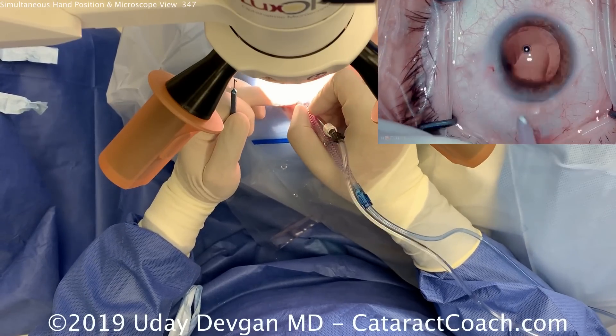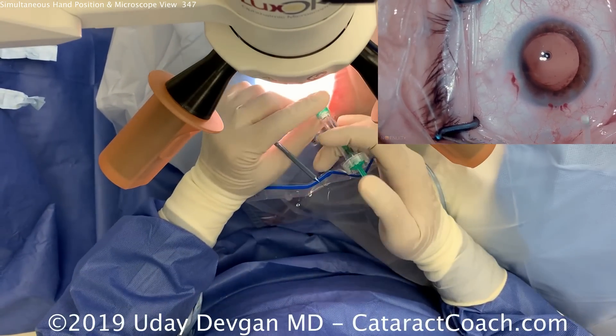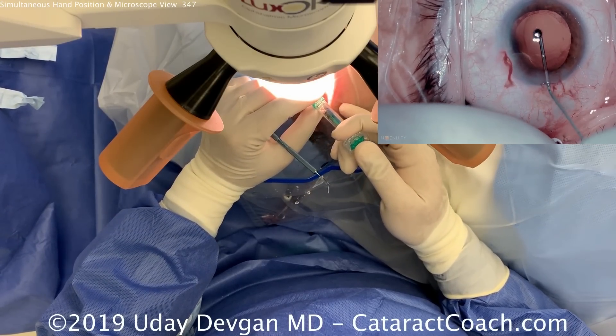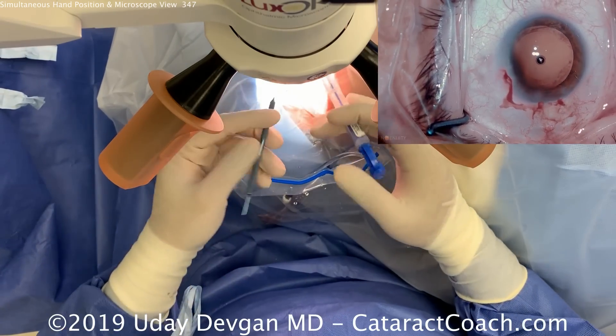We want to keep the eye in primary position. A little capsular bag polishing and we're done. Keep the I&A probe in that pocket and fill up the eye with our cohesive viscoelastic. That looks great — ready for the lens.